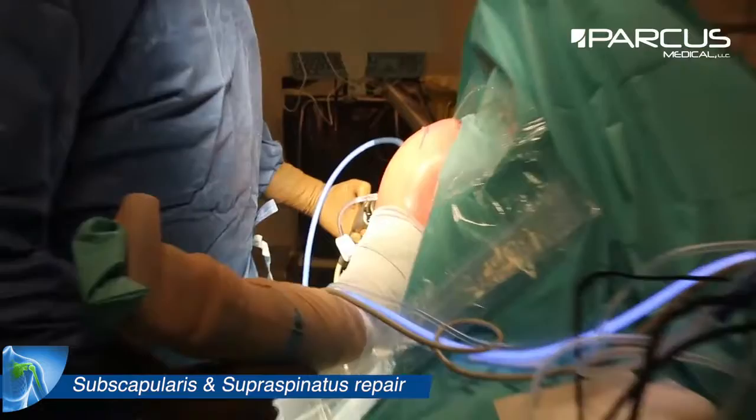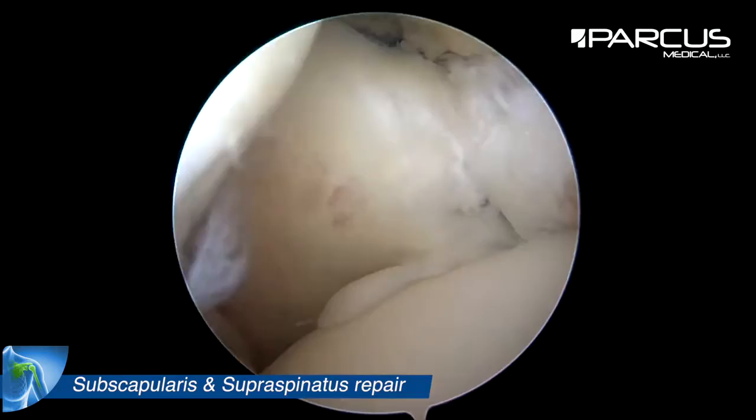And we also check the external rotation which needs to reach 40 degrees of external rotation.